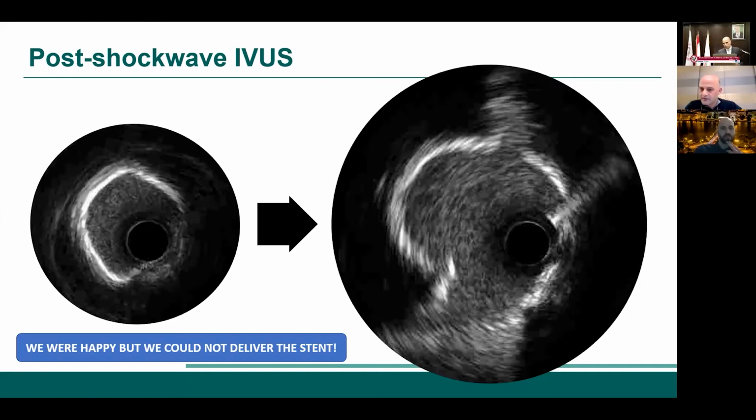I think this is a mechanical lesion obstacle that needs to be treated by maneuvering, like buddy wires, or a guide extension deep into the lesion. I think rotational atherectomy, if Dr. Edis will approve my comment. Absolutely. We'll hear Dr. Edis, and then I'll give you a bit of the thinking process happening throughout the case. But great comments.